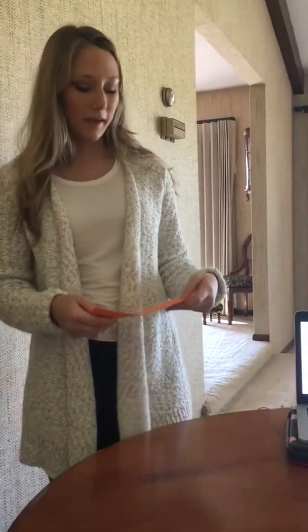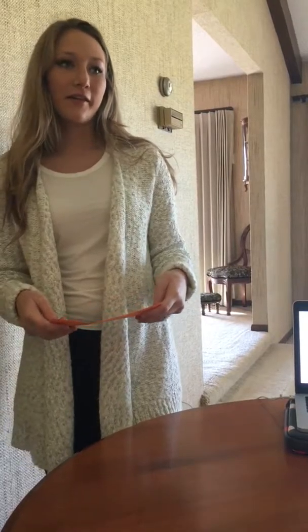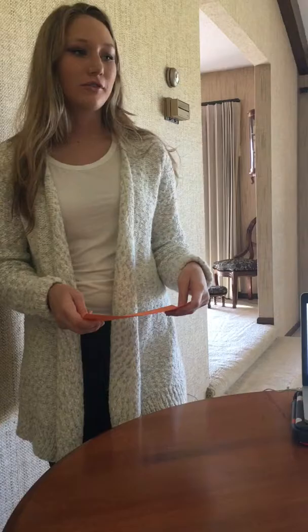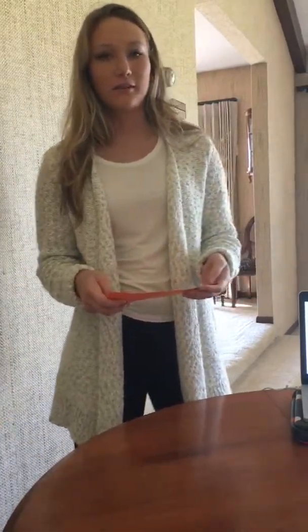Going to tell you guys about dental x-rays. There are many different types and ways to take dental x-rays. There are bisecting techniques and paralleling techniques. The bisecting technique is usually used when you can't get at the tooth at a certain angle.